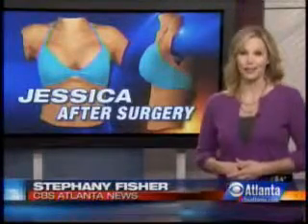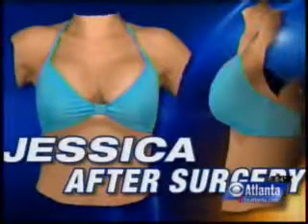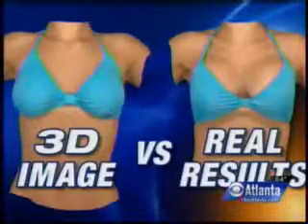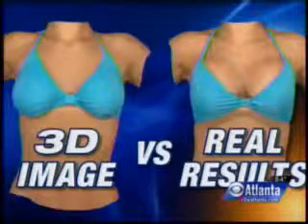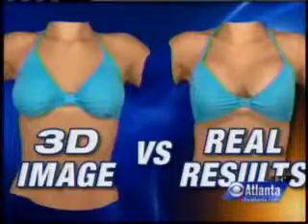Speaking of results, here's what Jessica looks like less than 2 weeks after surgery. Now compare that to the image Dr. Connors engineered on his computer. He says the implants are supported by special sutures right now, and that's why they're sitting so high on her chest wall. But he says they'll drop into place in just a few weeks.